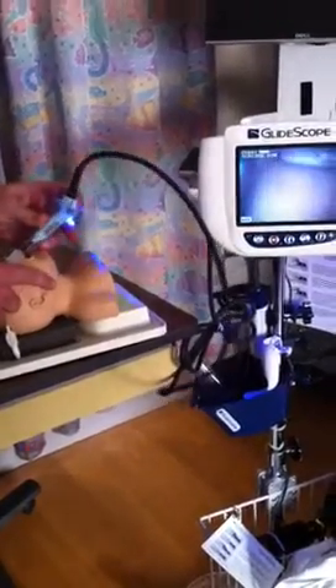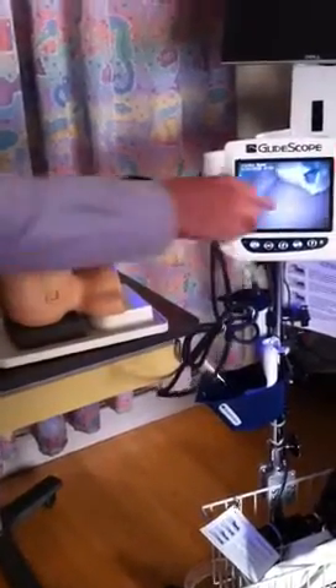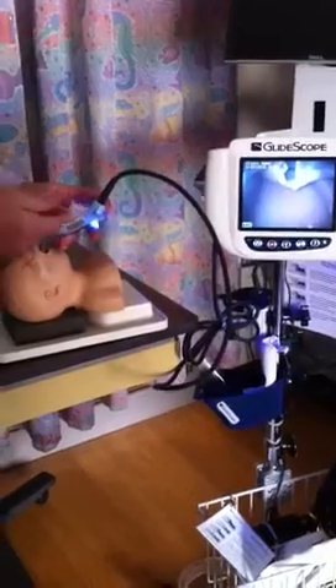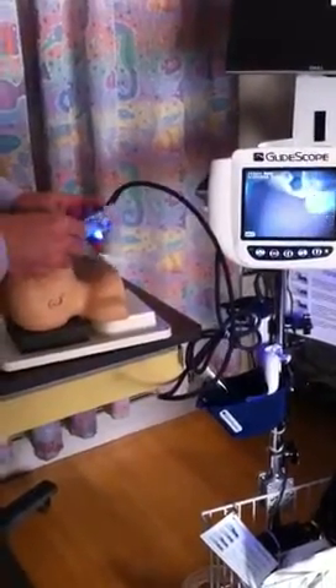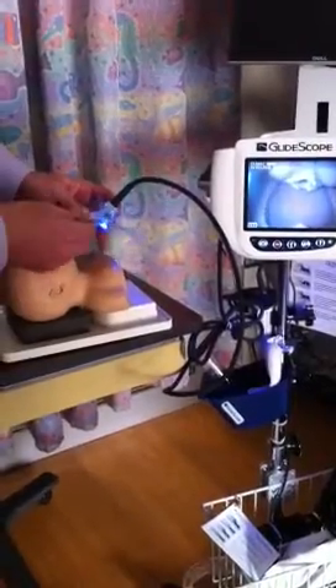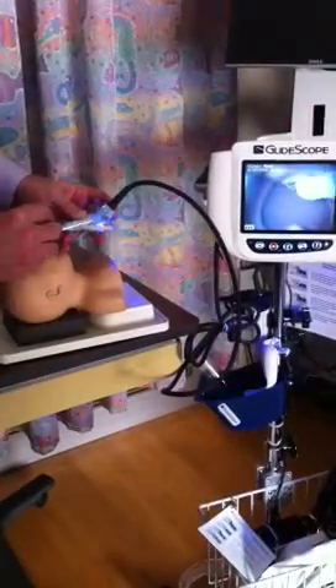One common mistake is going in too far and getting too good of a view. When I say that, it's centered right in here. It is going to be hard to place the tube because it's going to pop into your field of vision so quickly. The farther back you are, the easier it is. You'll see the tube enter your field of vision and then you'll be able to intubate from there.